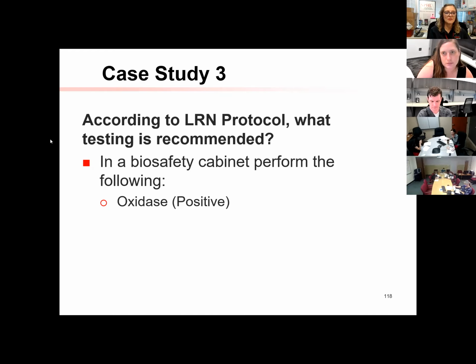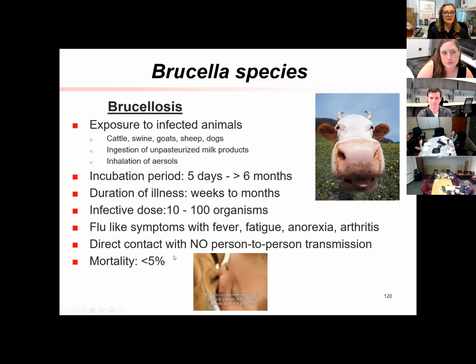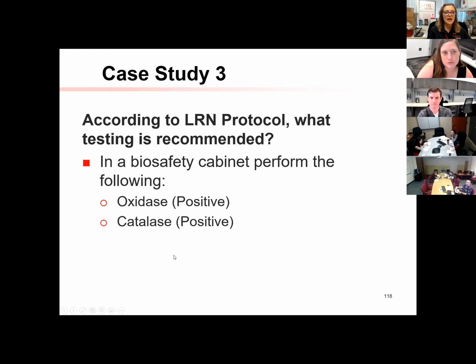Right, cannot rule out Brucella. Very good. So I just gave that answer away, but that's all right. All right, and then I would have you follow up. However, just because oxidase is positive, I'd still have you follow up with catalase and then with urease.